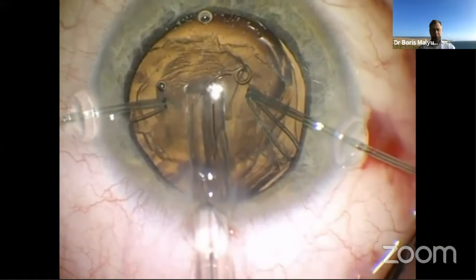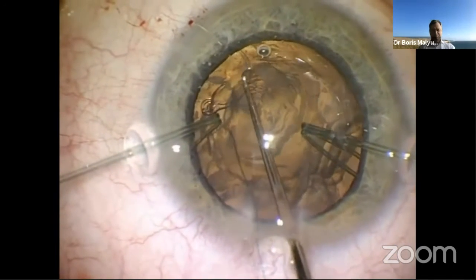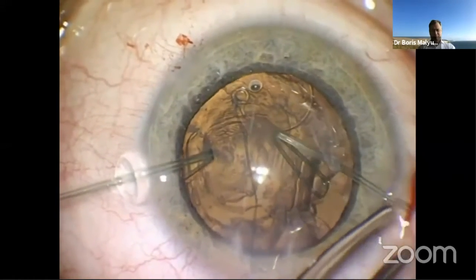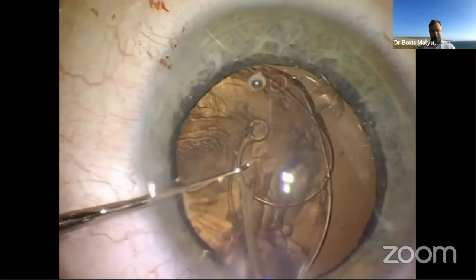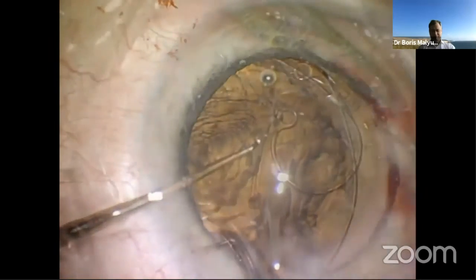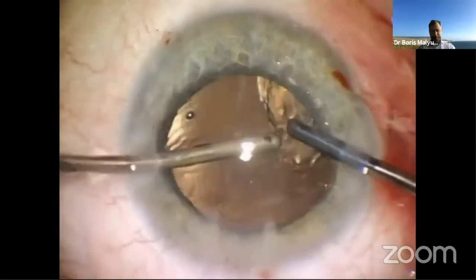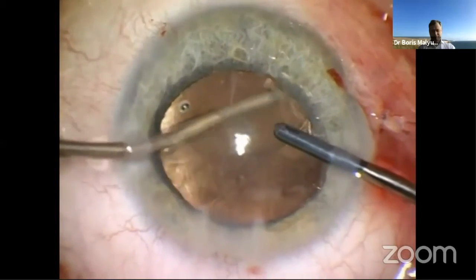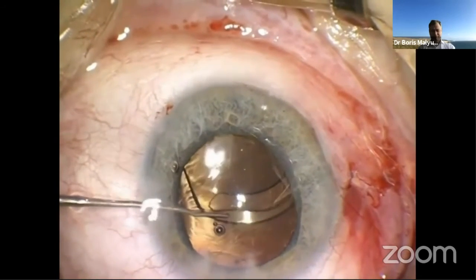The CTR is introduced into the capsular bag, and we can see that the suture is attached to the eyelet of the CTR. After rotation of the fixation element into the proper position, we release the capsular hooks and reposition the fixation element on top of the anterior capsule, as shown here. Then we pass the needle through the ciliary sulcus outside of the eye, aspirate the residual cortical material from the capsular bag, and implant the IOL in the capsular bag, positioning it so that the haptics of the lens are not interfering with the position of the fixation element.